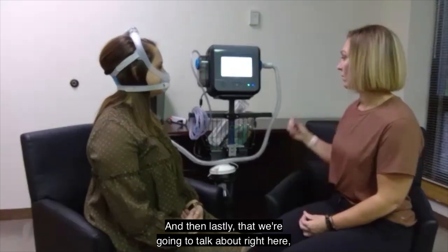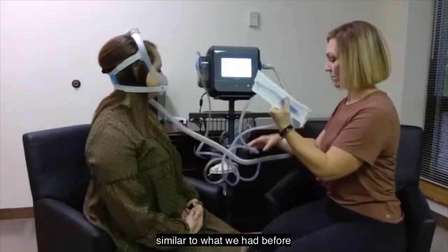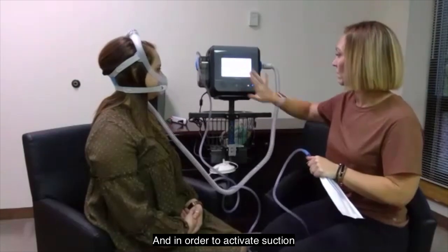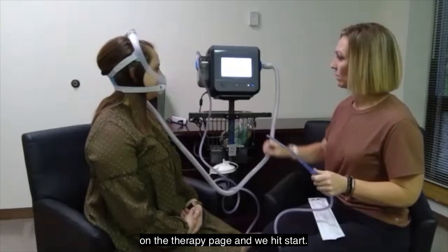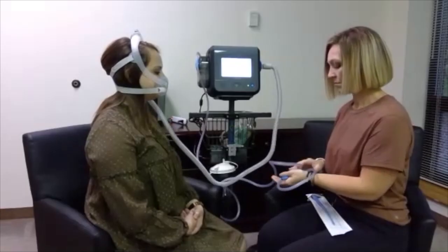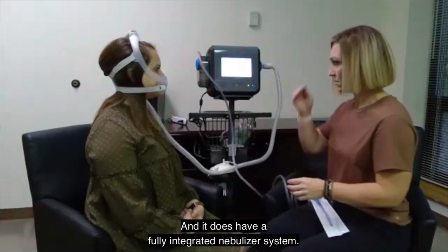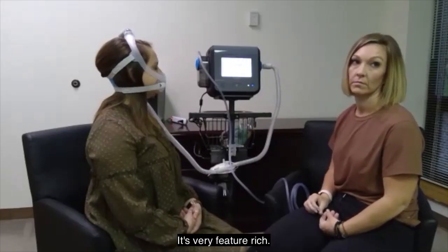Lastly, we'll talk about suction on the Voxin. There's a canister on the side similar to what we had before on the stationary setup. In order to activate suction, we simply touch the suction button on the therapy page and hit start. If needed, we could remove the mask and do some suctioning. It can also provide the equivalent of about six liters of oxygen flow and has a fully integrated nebulizer system. That's a very basic discussion of Voxin — it's very feature-rich and does a lot of different things.